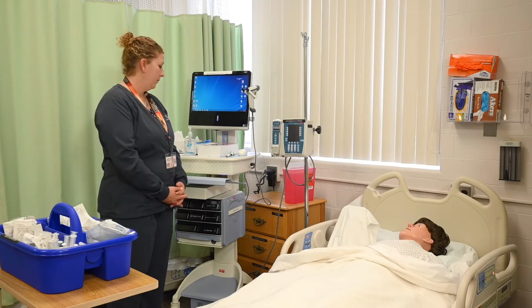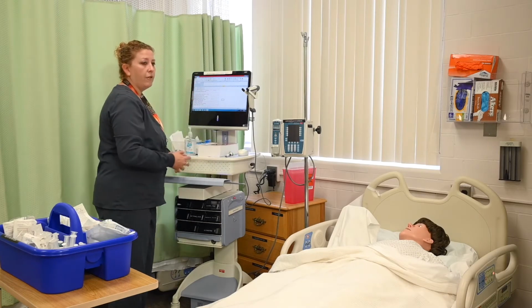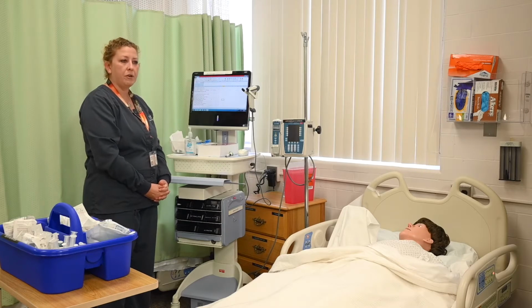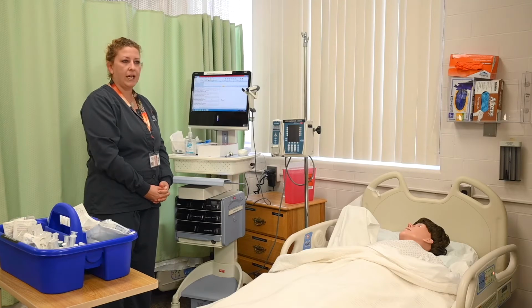So she will begin by verifying the healthcare provider's orders. I verified that there's an order for an IV start. We'll be administering 0.9 sodium chloride at 100 mLs per hour. Sodium chloride is an isotonic solution we're giving for dehydration today.